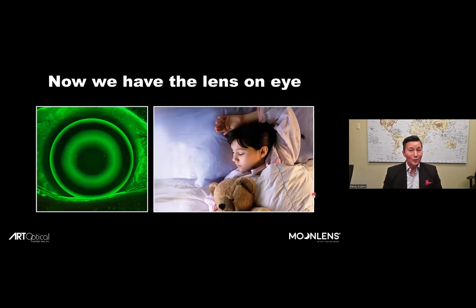I mean, unless you have concerns that the lens looks like it's bearing on the central cornea and it's moving laterally, like it just hasn't locked itself down, or if it's highly uncomfortable for the patient, these would be reasons to have pause. But otherwise, even if the fluorescein pattern doesn't look perfect, it's best to evaluate the lens post-wear, after those hydraulic forces have worked, after you determine where the lens settles after that lid force is over top of the lens. So let's get the patient into the lens. Let's see the patient after one night of wear.